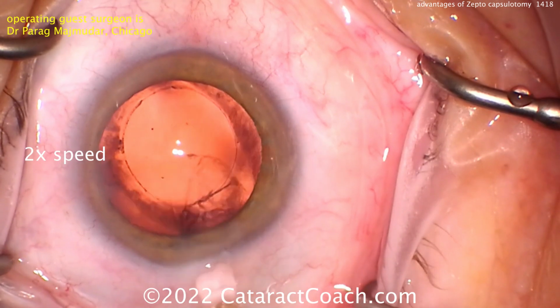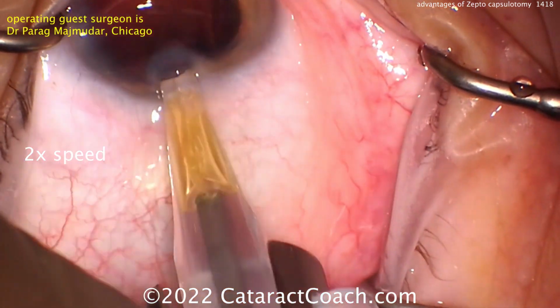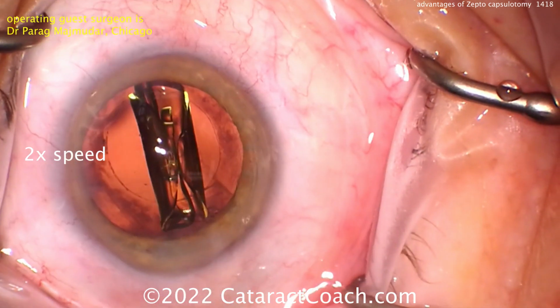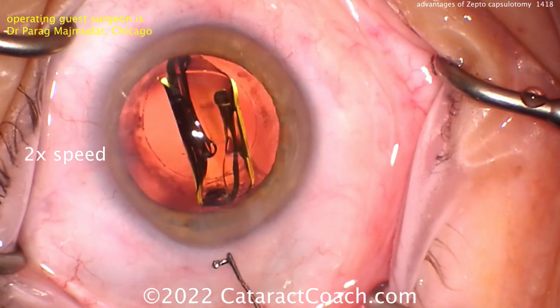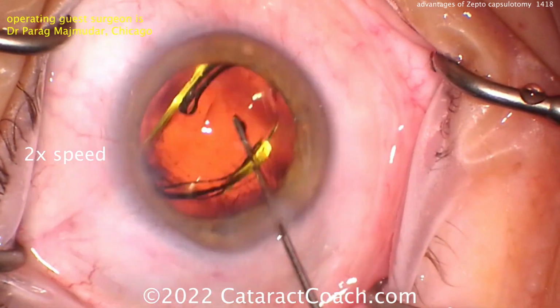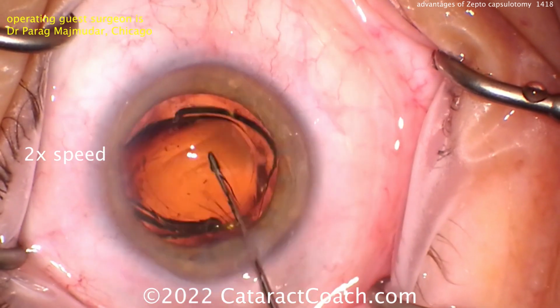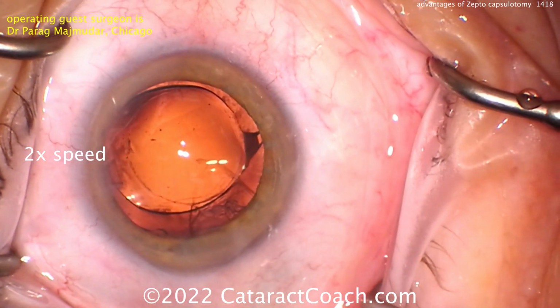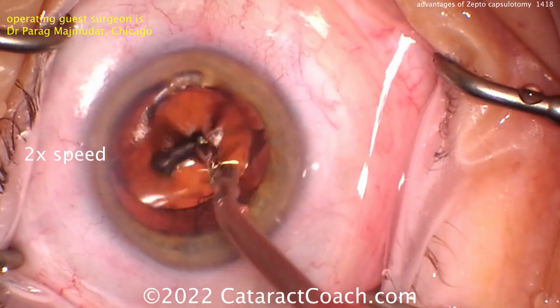Now, interestingly here, there's a little bit of subincisional cortex. I like this technique of first get the lens in the eye. You can use that to help loosen up that subincisional cortex and then remove the subincisional cortex. So a very nice technique there. And now as you see, as the lens opens up, you know that lens has a 6 millimeter optic. And then you can see that the capsulotomy is a very precise 5 millimeters.